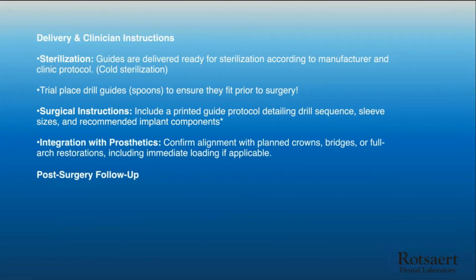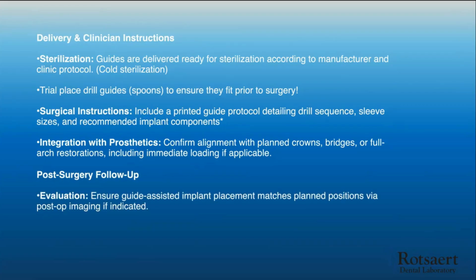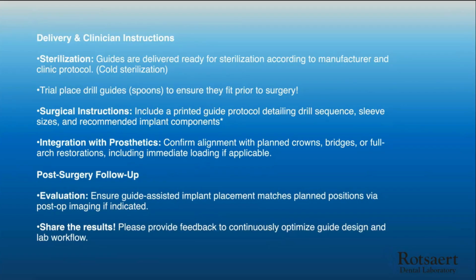All right. And then finally, sterilization of these guides. They're primarily cold sterilized. There were companies working on milling them and using other materials that you could properly sterilize, but they will distort. It is really just a splint resin or a modification of it, but you really don't want to heat these up too much. We don't want changes or anything like that.